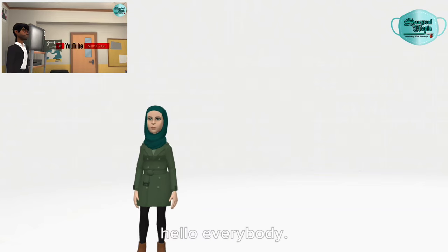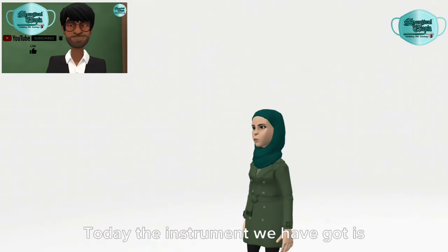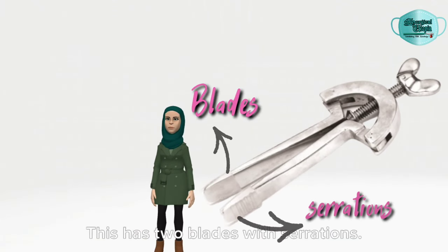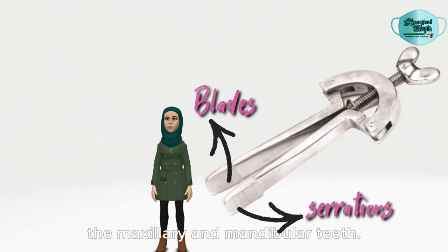Welcome to Surgical Utopia. Today the instrument we have got is the Hyster, a jaw opener device. This has two blades with serrations, and these blades are applied between the maxillary and mandibular teeth.